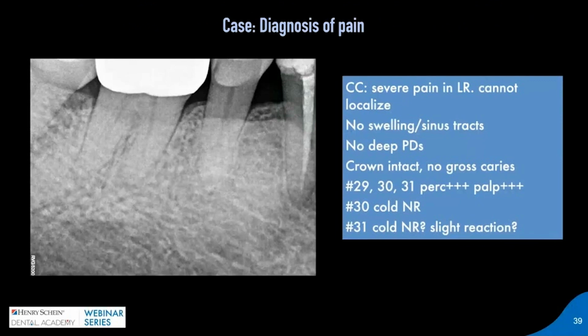Another reason to take a CBCT is when the patient has pain, again, if you have difficulties identifying exactly which tooth it's coming from. Keep in mind that this should be associated with situations where you're trying to look for a widened PDL or a thickening of the mucosa. So it has to be related factors. You may or may not see a periapical radiolucency. It depends on if there's pulpal necrosis or severe apical periodontitis.